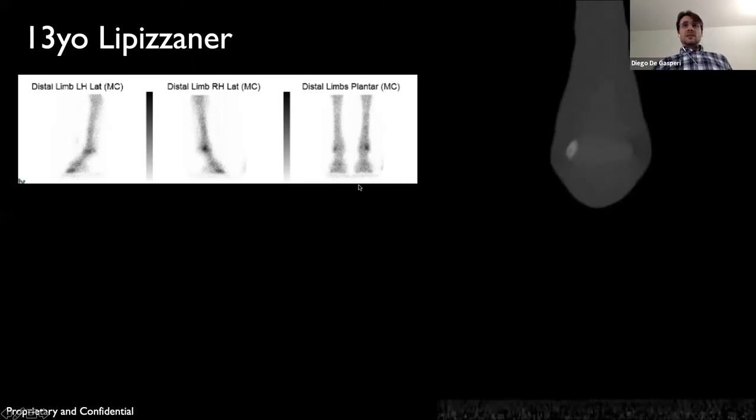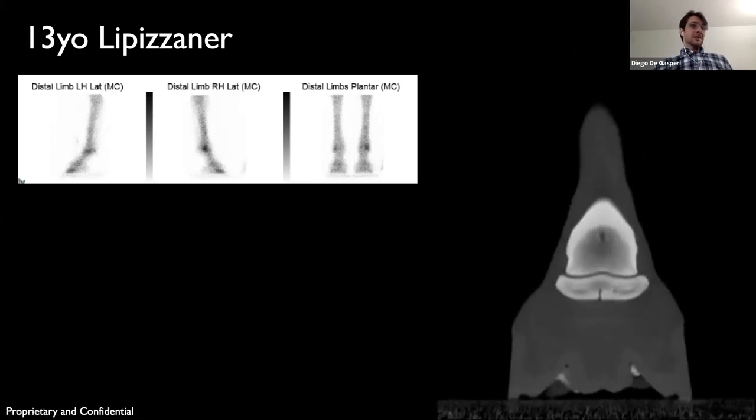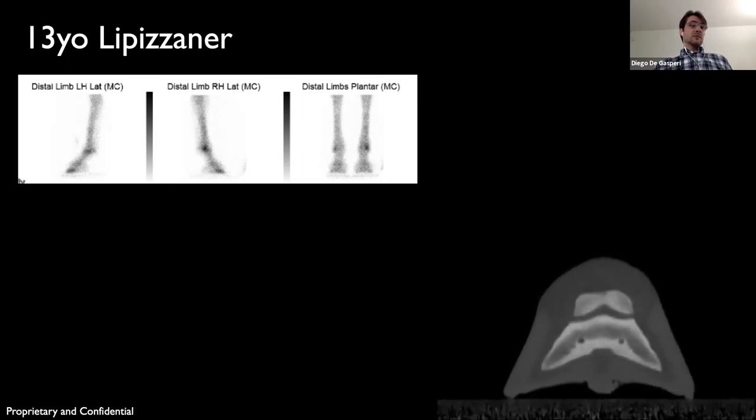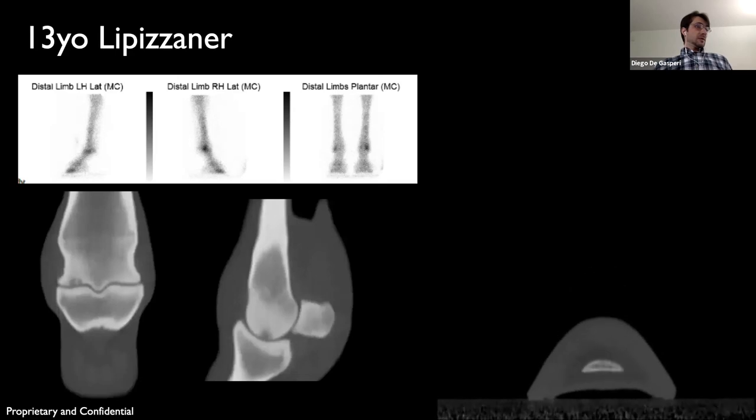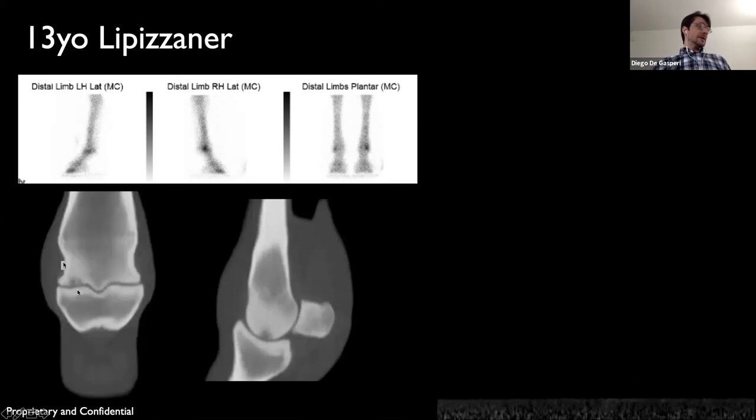So we did a CT of the horse and found again a subchondral cyst-like lesion on the lateral condyle, and this lesion was found on both hind limbs, most severe on the right. Again, these are images of the right side. A good amount of sclerosis surrounds that lesion, with a little bit of irregularity on the proximal aspect of P1 and the opposing articular surface. This is the only horse that I have follow-up on. This horse was injected with intra-articular stem cells, and it was reported recently that he's doing very well with that injection.